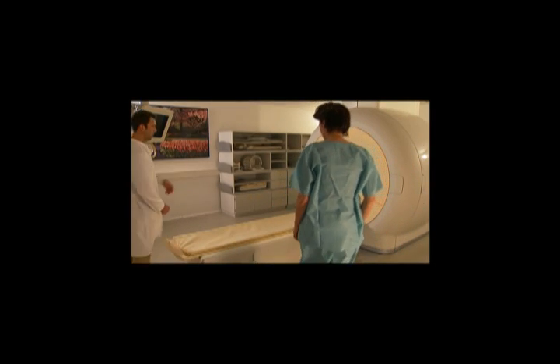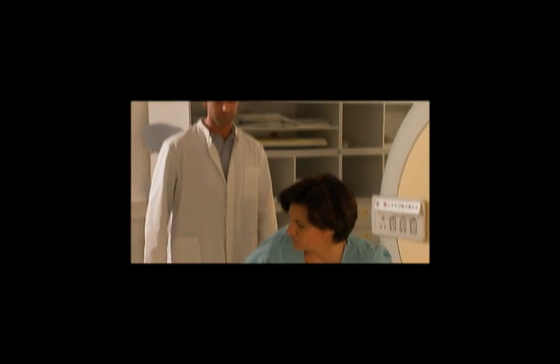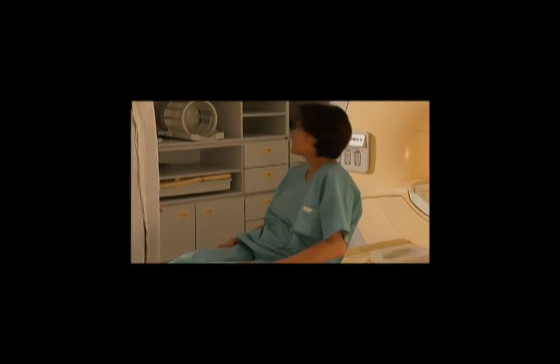Ensure that patients wear hospital gowns without metallic fasteners. Patients' ordinary clothing can contain magnetic objects or threads that may pose a hazard in the MR environment.